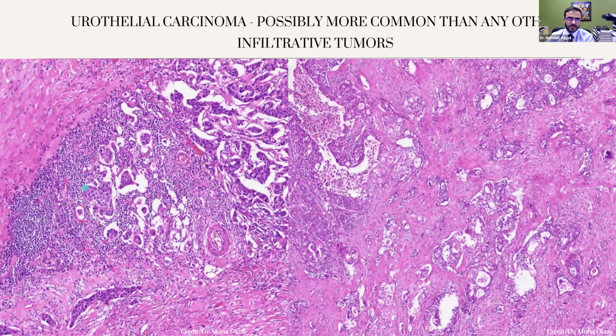Other, well, there's a typo here. It should be lost, but keratin, PAX8, keratins, and EMA are expected to be positive in this case, and OCT4 should be negative. GATA3 and P63 should be negative. I'm kind of suspicious about mainstream sentences about GATA3 because you never know. Sometimes GATA3 can be positive in some unexpected tumors. I will give you an example very soon. So I wouldn't rely on GATA3 positivity when I call something urothelial carcinoma.